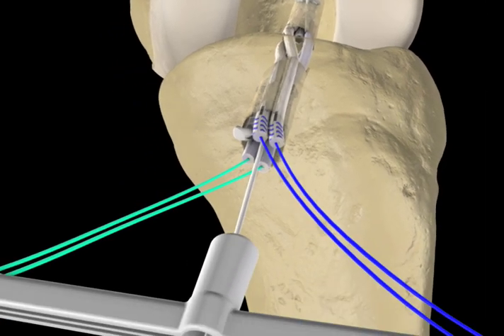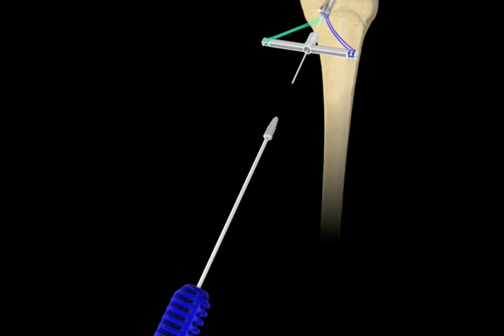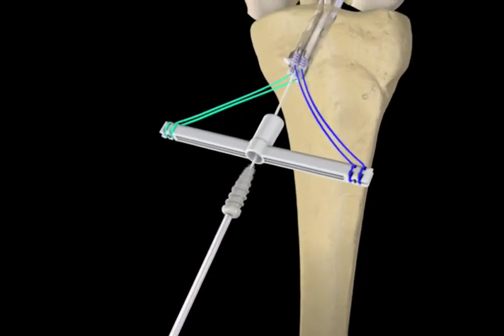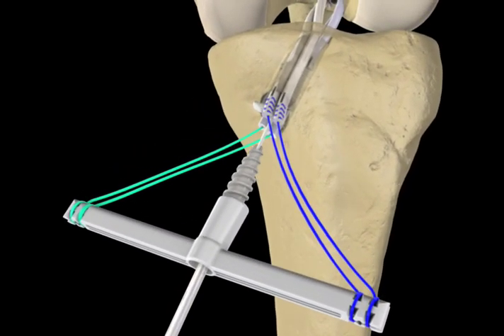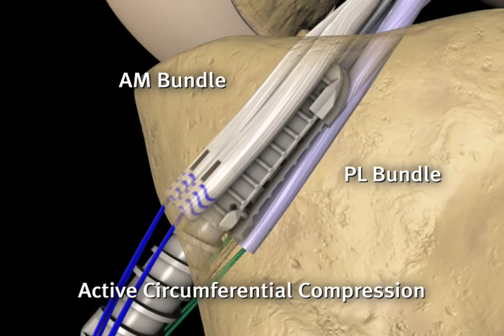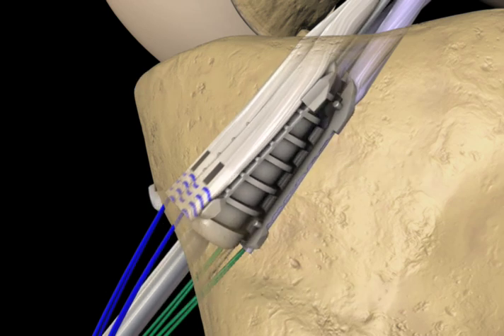Next, the sheath holder is removed from the inserter and the tibial screw is loaded onto the inserter. The tibial screw and inserter are loaded over the guide wire through the tendon expander until the tip of the tibial screw engages the tibial sheaths. The inserter is then turned clockwise between the two-part sheaths to deploy the tibial implant, providing circumferential compression of the graft.